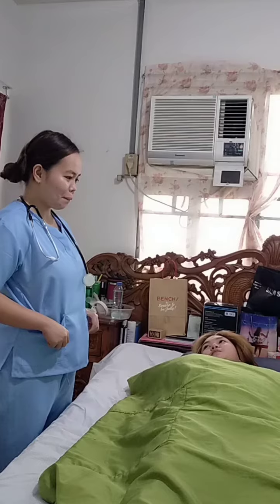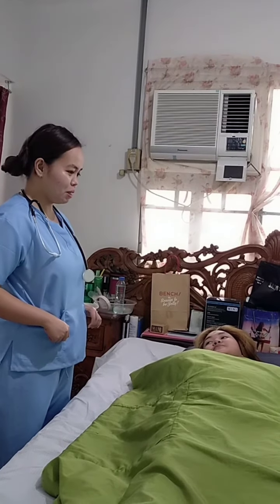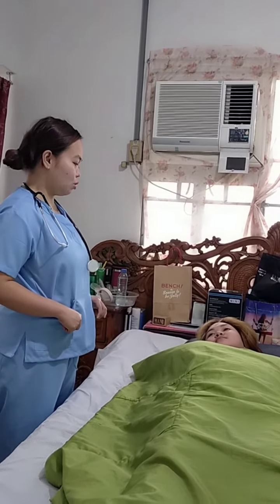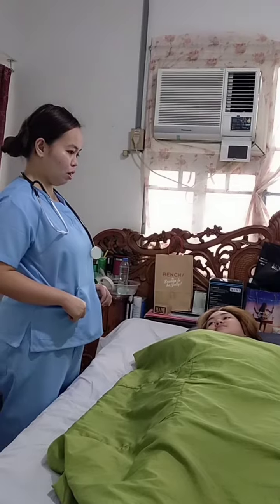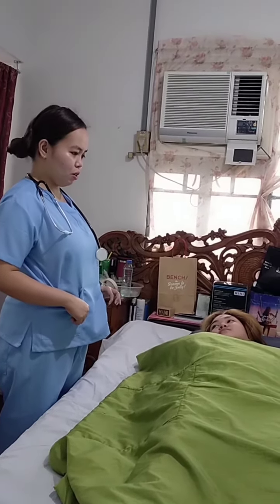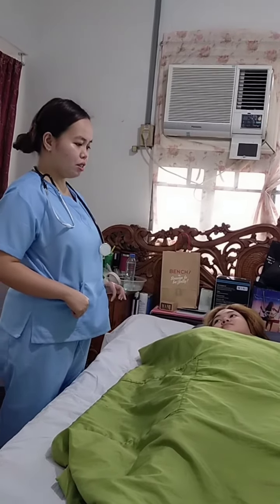First, we have to check the doctor's order for insertion of the nasogastric tube. This clarifies the procedure and time and the equipment required. Then explain the procedure to the client. Explanation facilitates the client's cooperation. Hello ma'am, good morning. My name is Princess, your caregiver for today. We'll be doing the insertion of a gastric tube through your nose so that we can feed you properly. We have to gather the equipment because organization provides accurate skill performance.